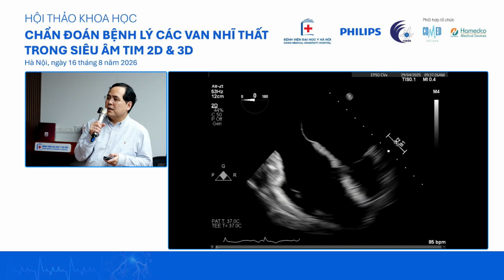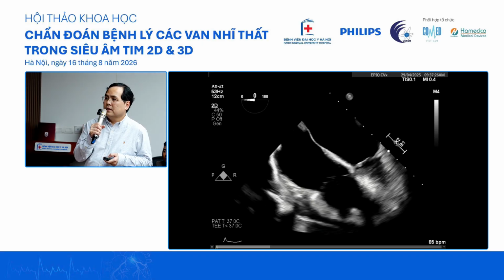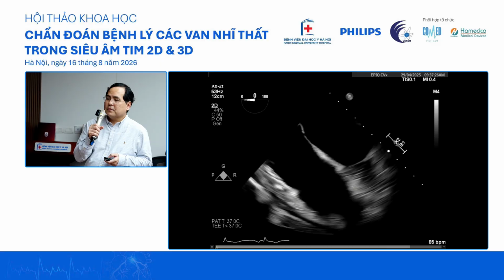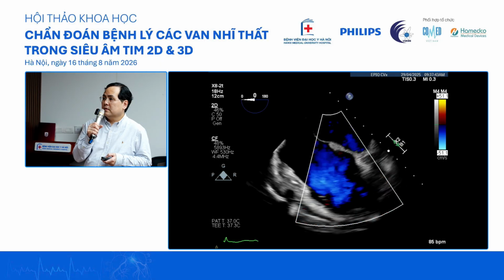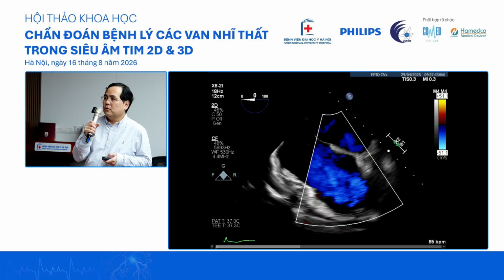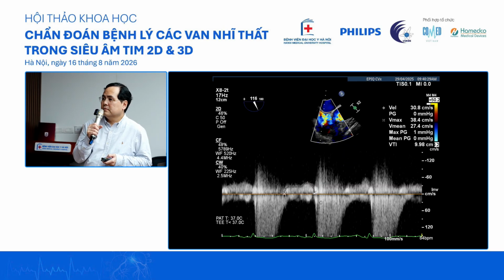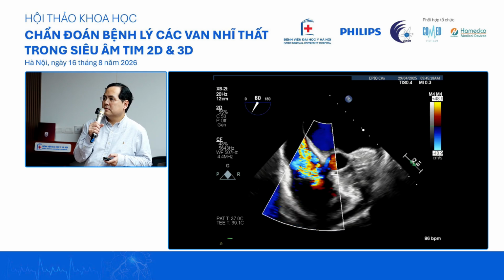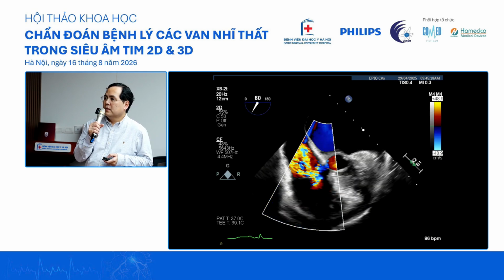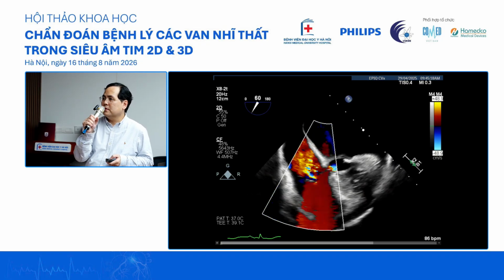So this is the mid-esophageal four-chamber view. You can look at the septal and the anterior leaflet. If you go in deeper, you can get the septal and posterior leaflet. Okay, so to get the tricuspid regurgitation, use color Doppler. You can do a mean gradient here from the CW signal. In this case, the gradient is less than 1. So you get the septal leaflet and the posterior leaflet.